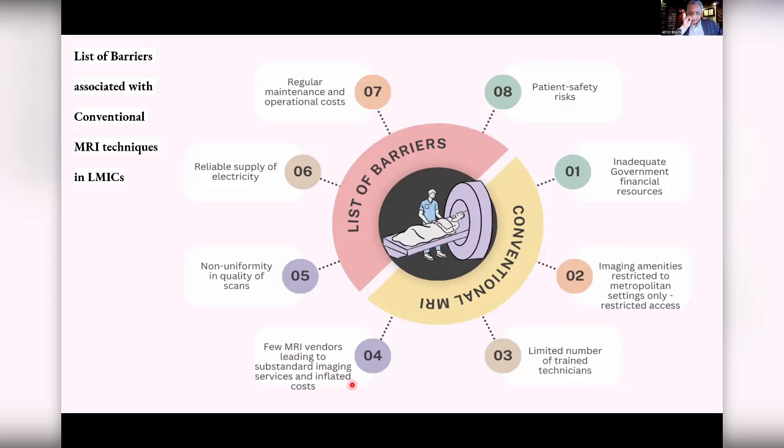And the MRI vendors, obviously, there are a few, and there's somewhat of a monopoly, which causes inflated costs. Since the MRIs are not enough, there's a non-uniformity of quality of scans, and the supply of electricity is always an issue. Right now, as I'm speaking, in the back of my mind, I have this fear that the electricity may suddenly go off, and I will have to start my generator, which will interrupt this for about a minute. But this is an issue all over the country. And then the regular maintenance costs and operational costs are much higher in the conventional MRI, and the patient safety risks are also an issue.